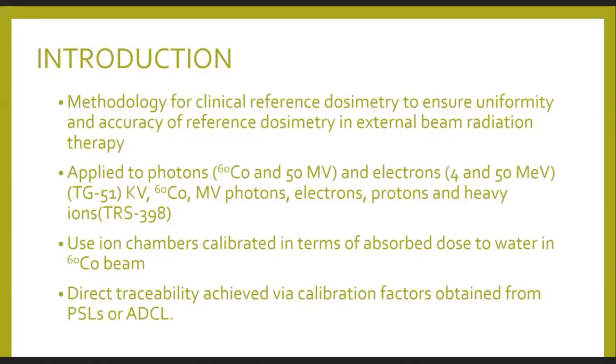What we mean by traceability is that if we have a radiation quantity and we measure the absorbed dose from that radiation quantity, let's say 1 gray here, it is supposed to be the same value measured elsewhere, whether in North America or Asia, etc. So in other words, when we say that this chamber is traceable, or our measurement is traceable, that means it's calibrated in a primary standard lab or accredited calibration labs, such as what we have in our institution.